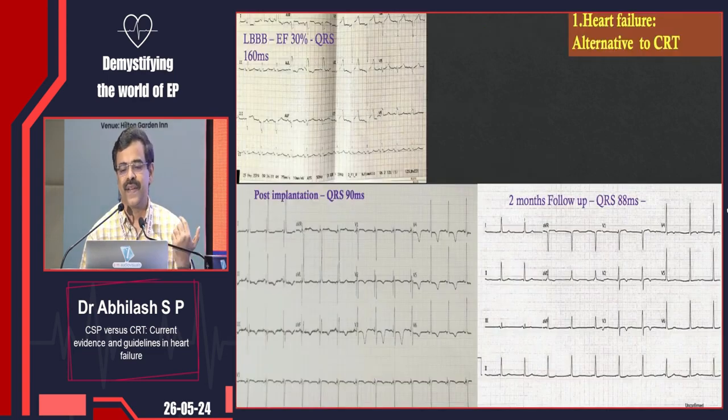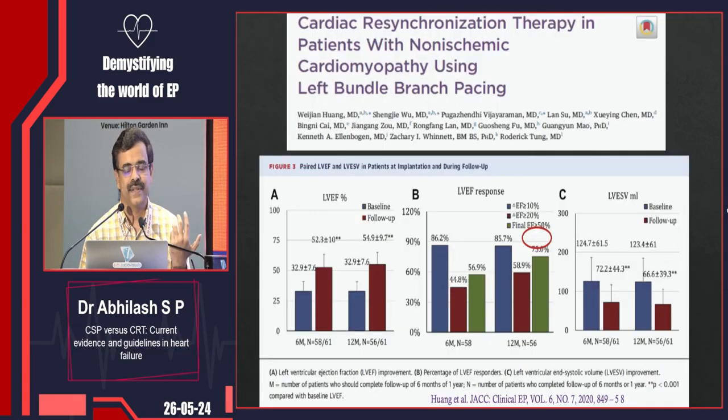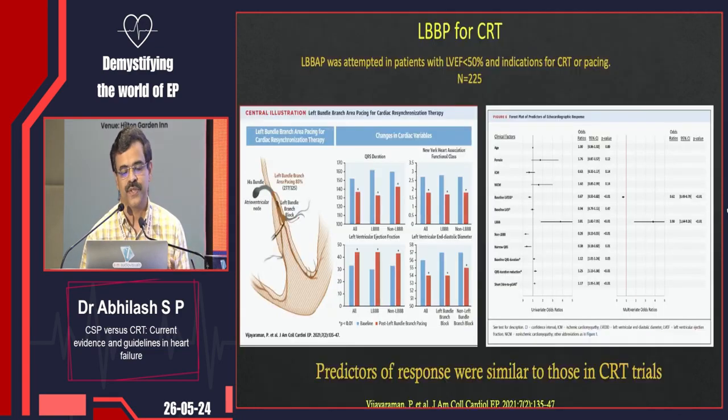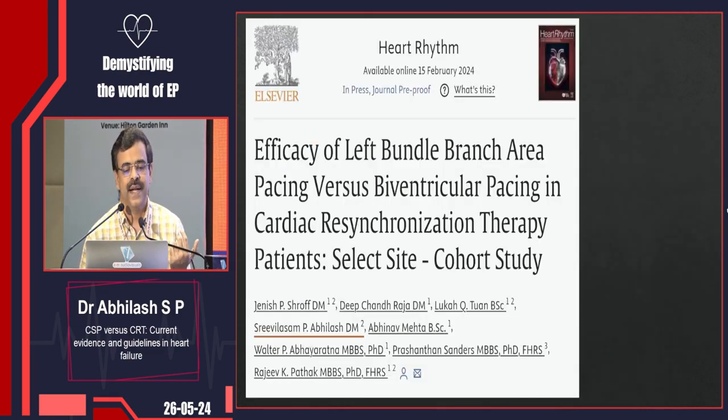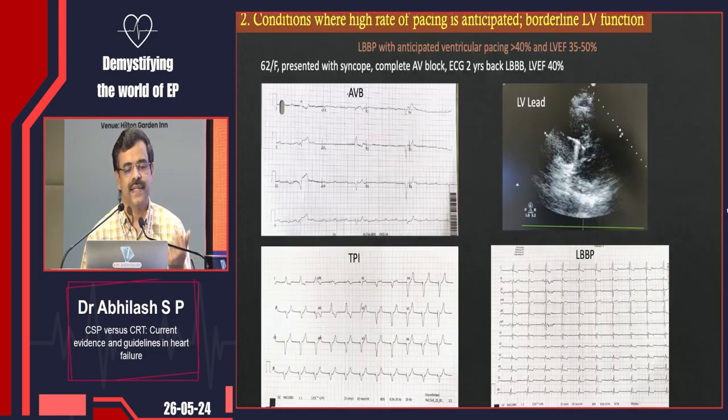And this one case where we have done heart failure alternative to CRT, you see the beautiful ECG from the left upper corner to the right on follow-up. It remains the same, narrow on follow-up with just 2 leads. So simple, right? Then it's not theory. We have enough data now. It started from a Chinese team, then reproduced by Pugazhendhi sir and Shanmuga Sundaram from different studies, and one study from Australia where I could also be part of. Then that is the evidence so far with respect to CRT in heart failure.